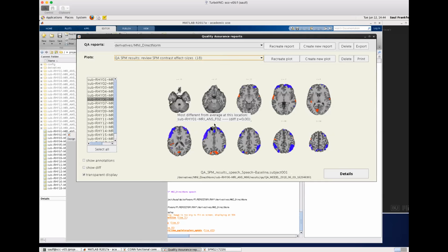So we might try to be a little more conservative with motion, or with how we correct for it. How did you specify the design for this subject? You could try, for example, including higher order derivatives, quadratic terms for motion effects. You probably included the default linear motion and ART, right? So perhaps you could try quadratic terms for motion, just to see whether that helps, or include a more conservative ART. But given that this subject already has fewer scans, that might be difficult.